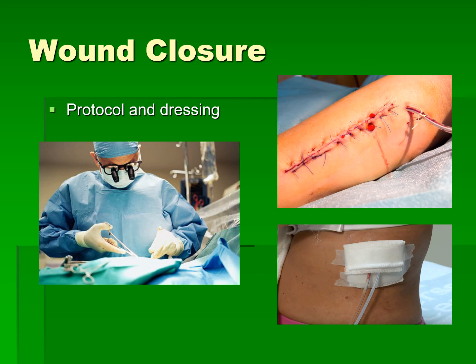As they're closing the wound, they're going to use multiple stitches to close the layers. And so you're going to be still passing stitches, maybe changing forceps, sponging, cutting sutures, anticipating the drains, doing the count, or not the drains. Sorry, I was looking at this picture with the drains here, but of the wound dressings. And then when the surgeon is done closing, you're going to get a wet sponge and a dry sponge so that they can clean the wound. And then together you'll place the dressings.